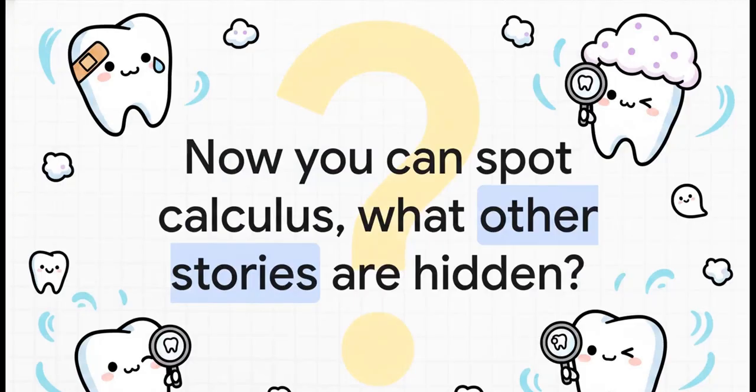We've learned how to spot one very specific clue today, but a radiograph is just jam-packed with stories about a person's health. Stories about decay, bone loss, maybe even an infection. So now that you know how to look for one piece of the puzzle, what other secrets do you think you could uncover? Thanks for coming along on this little explainer with me.